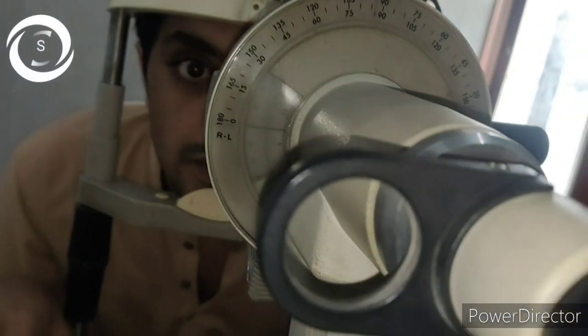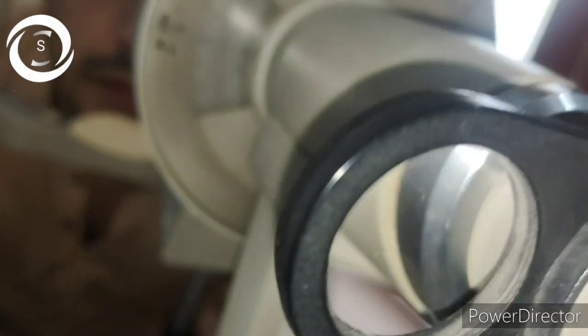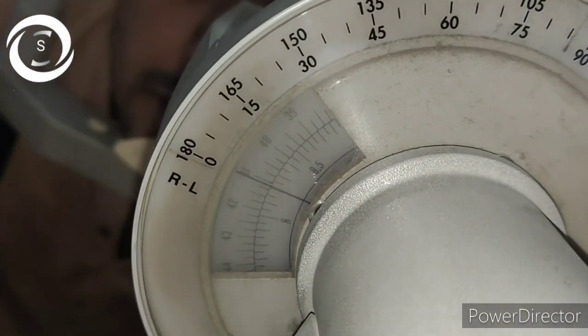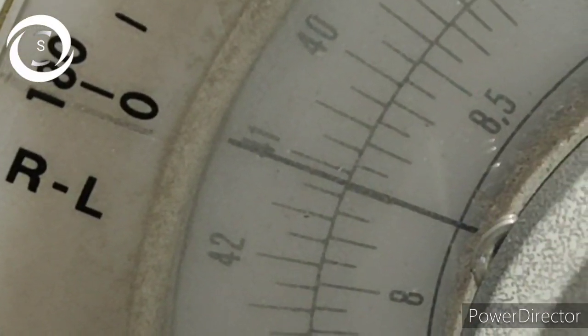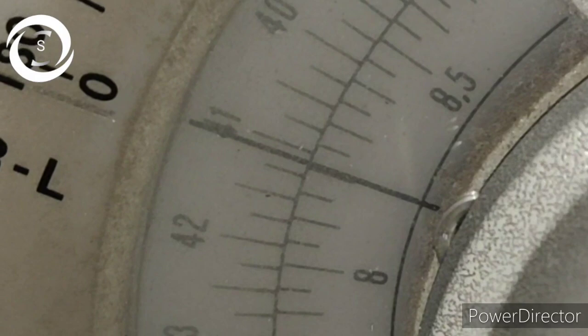The objects should not overlap each other. When the image is well focused and aligned then check the reading from the superior dial. So this patient has 41 diopters K1 and 41 diopters K2. Here you can see now if you see distorted image at 90 and 180 degrees then you can rotate the axis dial to get clear image and measure accordingly. So in this patient there was no astigmatism and you can see 41 diopters at 180 degrees as well. So this patient had the same reading on both meridians and that's how you measure keratometry through manual keratometer. Thank you.